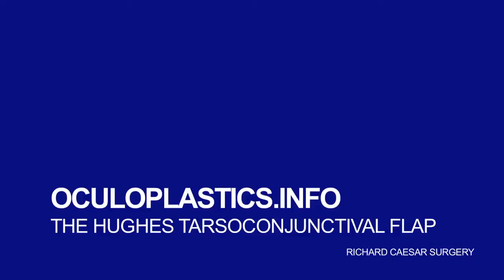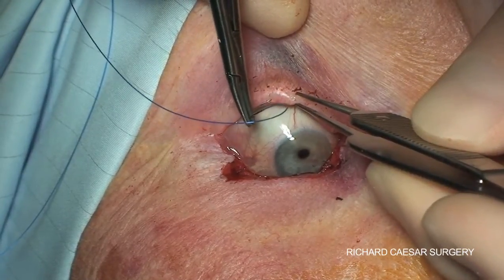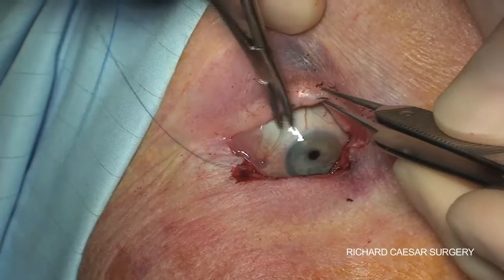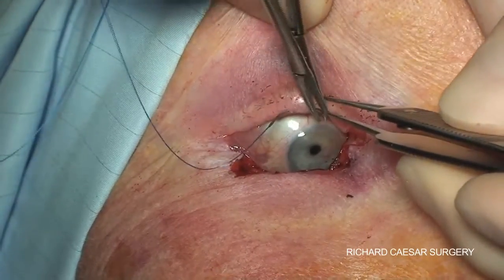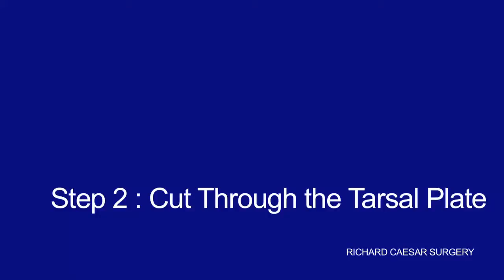The Hughes Tarso-Conjunctival Flap is such a useful and versatile flap that it deserves its own video. The key steps are to have control of the upper lid. When first learning, it's useful to put in a prolene suture and fully evert the upper lid over a lid guard.